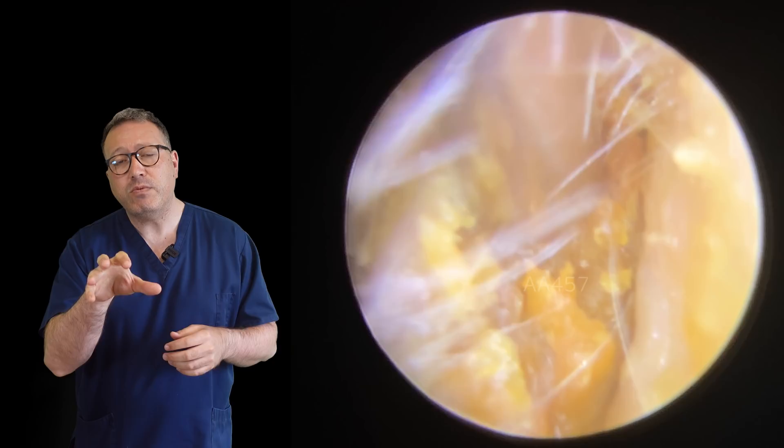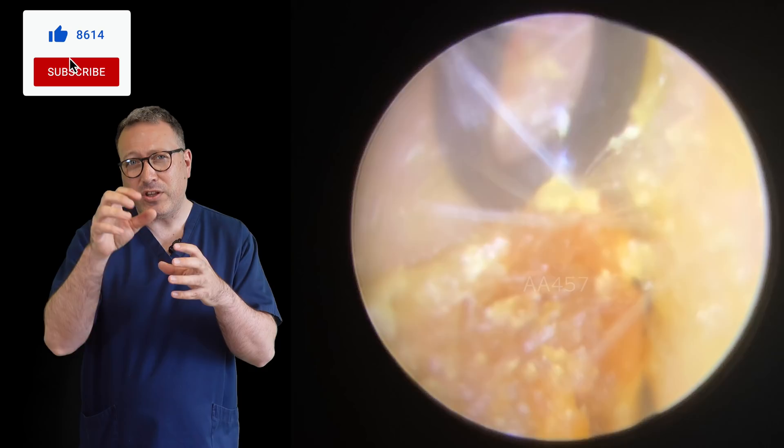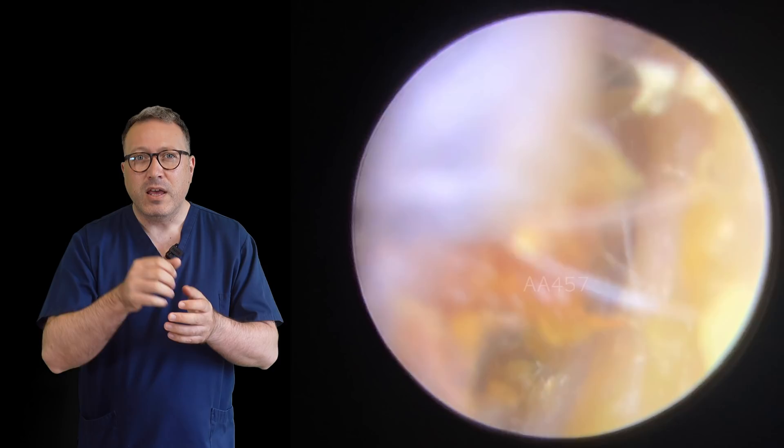So what you can see is we've got the standard size Zolnir tubing here. We're just drawing this along the front end of the wax, just breaking these little bits away, but it's quite firmly compacted together. So we're going to go in with the Jobson horn. And what you'll see is as we bring this forwards, we've got these interspersed layers of wax and skin and debris in there. As you see this coming away, you lose a little bit of visualisation because we hit the cilia on the outside part of the ear canal.